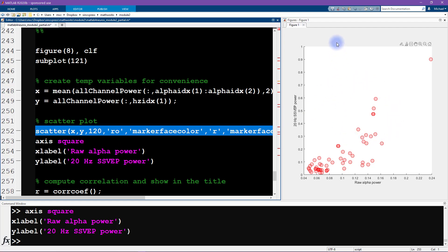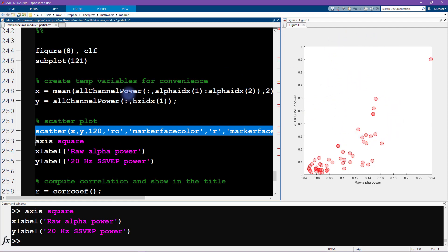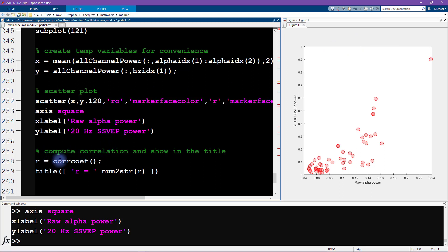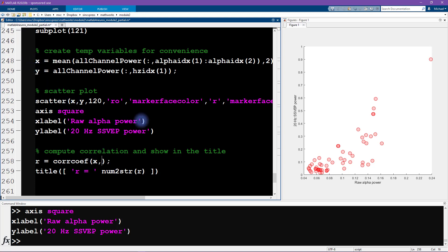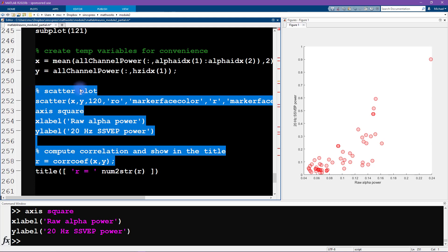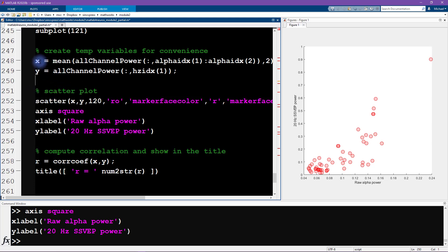I encourage you to spend some time playing around with this line of code with these optional inputs and see if you can find a different color scheme and transparency and marker scheme. So this is most of the plot; we still need to add a title. The title shows the correlation coefficient, so I'm going to use the function corrcoef.